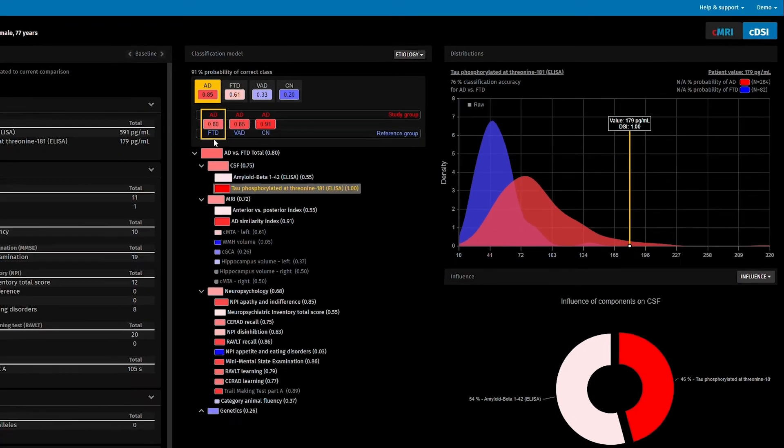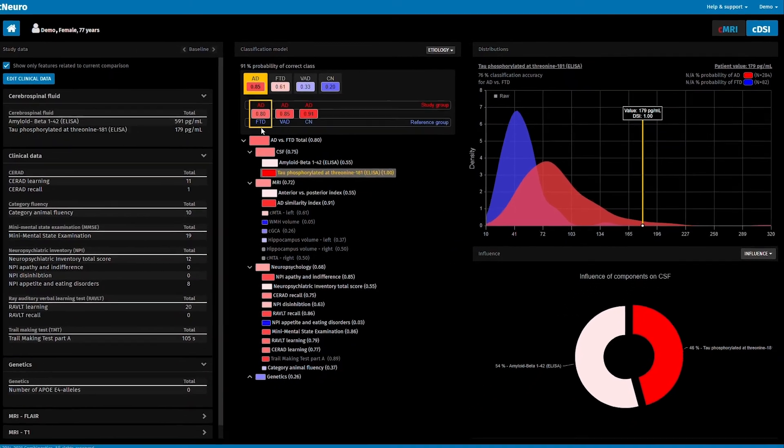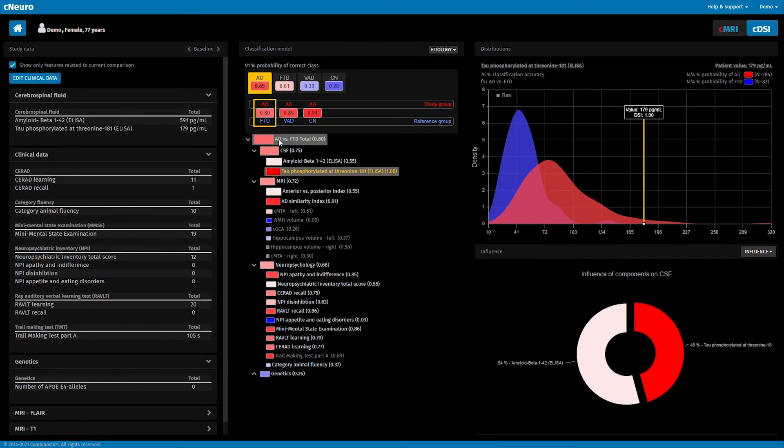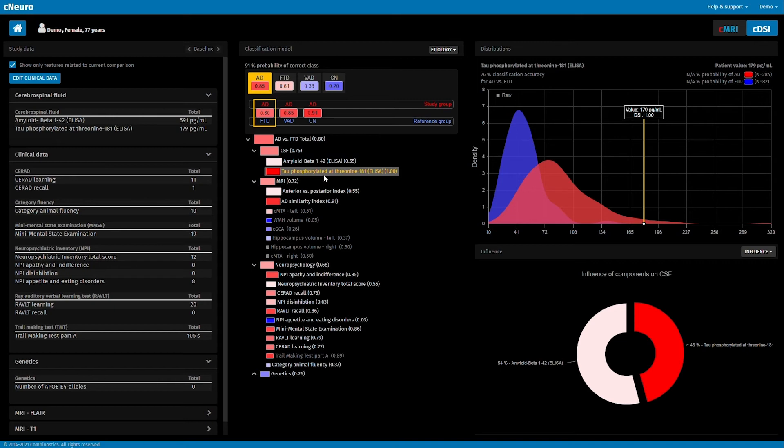With one glance, the clinician can get an overview of all data, see the importance of each biomarker, and view the most likely disease based on these data. In addition to the etiology model, there is a progression model used to predict the likelihood of a patient with mild cognitive impairment progressing to dementia.